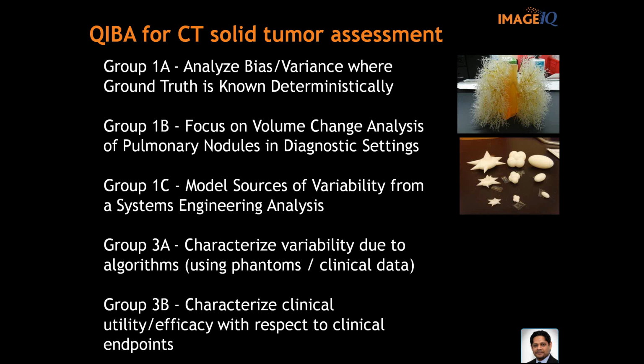But how do you want to apply automated software to a clinical trial? One of the things you want to do is make sure you have a standardized image acquisition protocol, right? If you're planning for a clinical trial, make sure that every site that you're using is using the same image acquisition protocol for the given scanner, and that includes parameters like field of view, kV, current, even dose control, right? Dose control for every vendor is slightly different, and that will affect what kind of scan quality you get. A lot of noise if that's not controlled. I mean, these things are pretty detailed. You really need someone who knows what they're doing to match these up across multiple scanners.